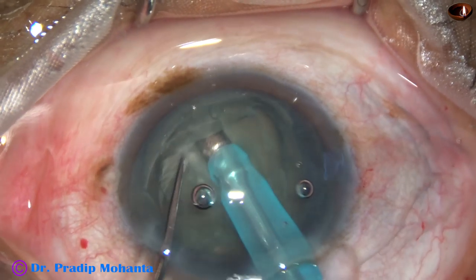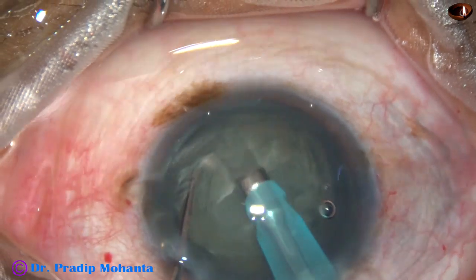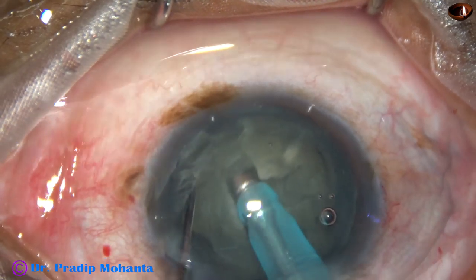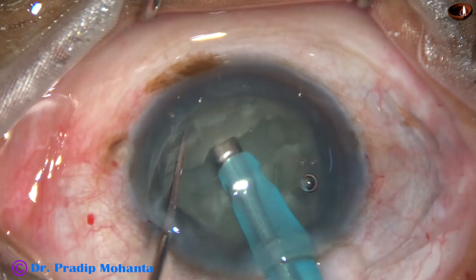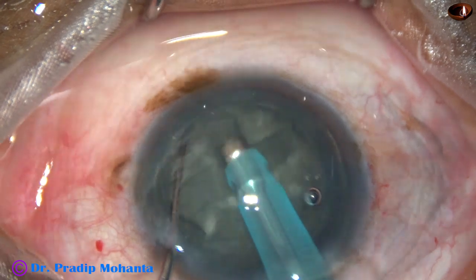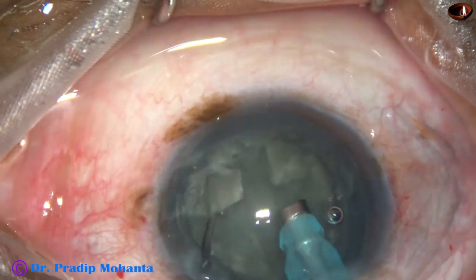And now I rotate the nucleus 90 degrees and make a trench on the hemi nucleus. Rotate it again and lengthen the first trench. Rotate again 90 degrees and make the trench on the other hemi nucleus. In this way, a plus sign has been made.